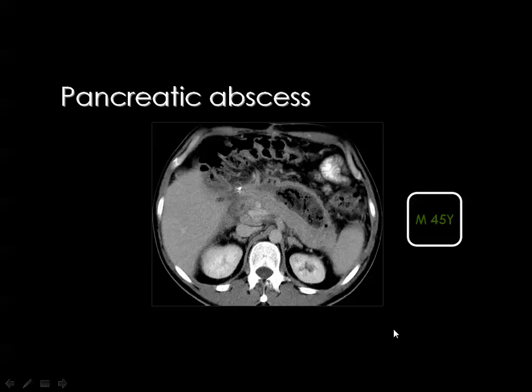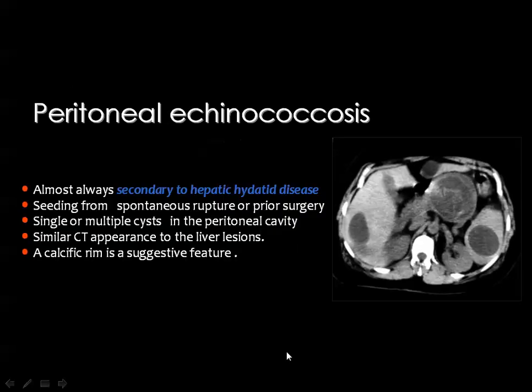And also I have said that this air is not frequently seen inside the lesion, and if you cannot see air, you are not able to distinguish between abscess and pseudocyst in spite of the clinical data. And frequently we put a percutaneous needle or catheter in the collection and get some fluid for analysis.